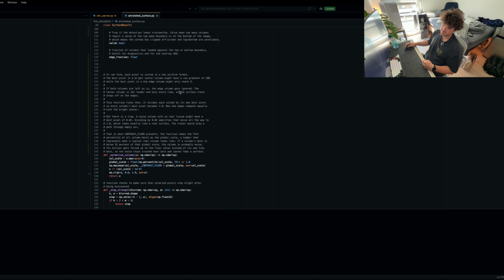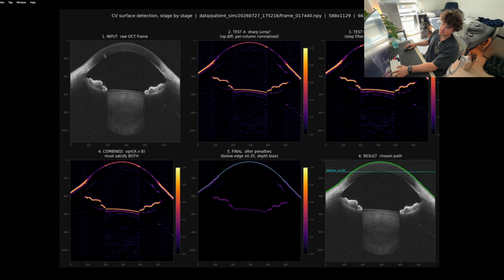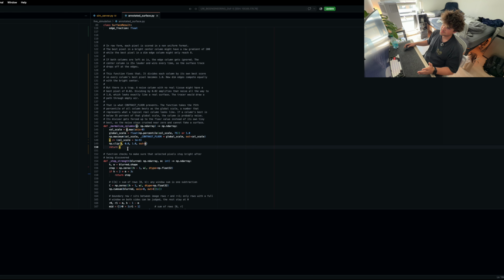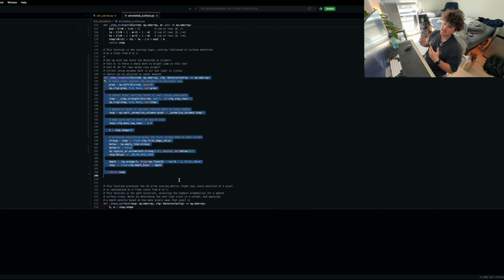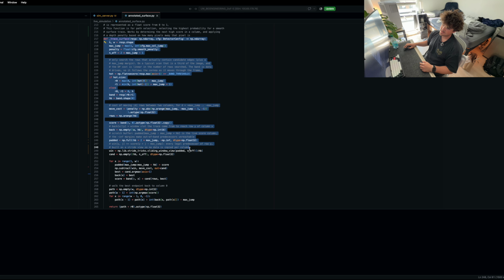The main components are done with these functions. You start off by normalizing the columns. So like these regions right here, the dimmer portions should not be ranked as low just because they're dim. So we go through each column, we figure out the highest score that each column has by default, and then we inflate those scores to match a standardized system where 1 is the brightest of that column, 0 is not as bright. This function is that second test that we talked about where we check to see if after a detected bright region, it stays bright. That's what this function handles. This function determines what is likely to be a surface. The idea being the first detected bright spot should be the surface, ideally. So anything below that will be ranked lower in terms of our 0 to 1 scoring system. And then this is the entire logic that handles the path selection.